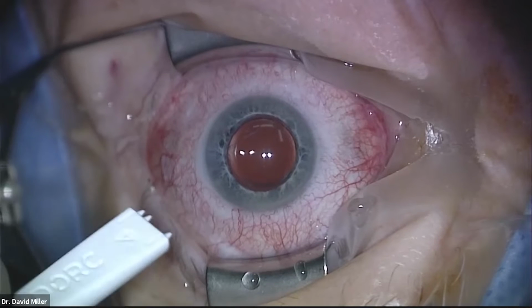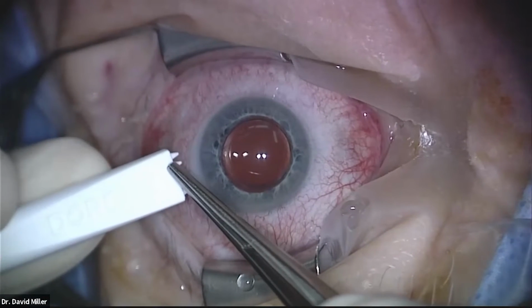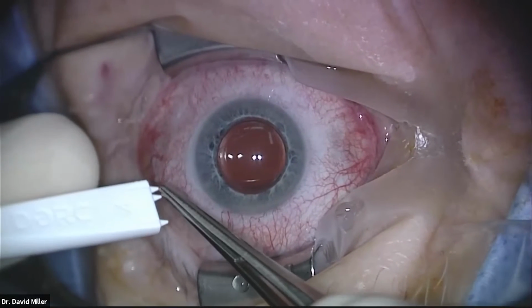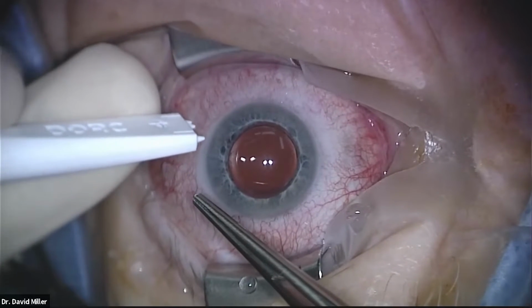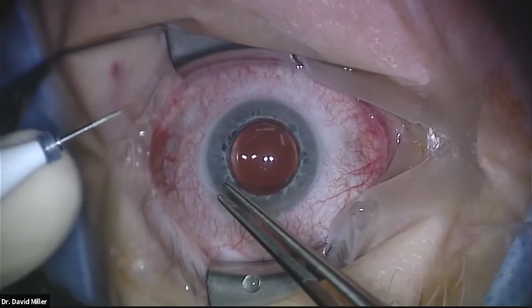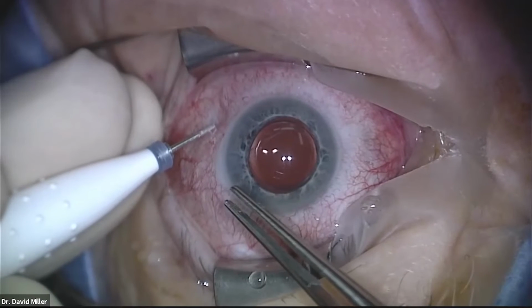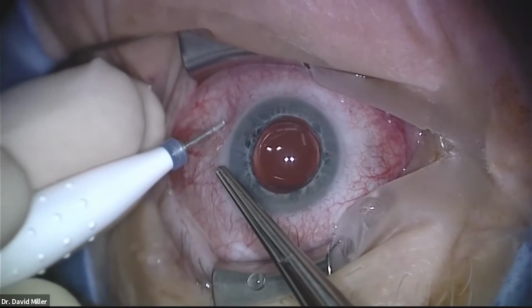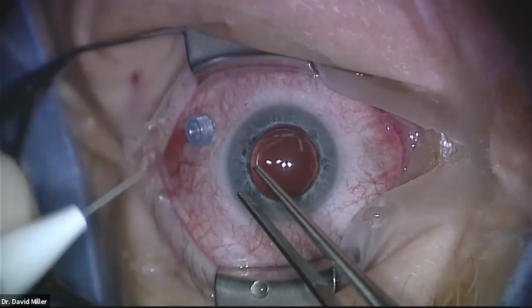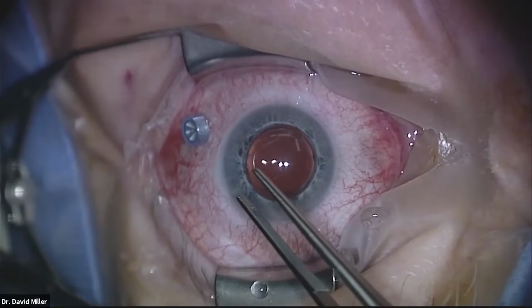So Mike is giving me the first trocar and cannula, 4 millimeters to the back mark, 3 on this one to the front mark. So the front mark's 3, the back one's 4. And we measure from the limbus. I tend to put the sclerotomies all in first at an angle, a beveled incision, pretty much 45 degrees or less, maybe even 30, and just push them all the way in like that. I don't go up and drive in. I want a longer tunnel through the sclera.